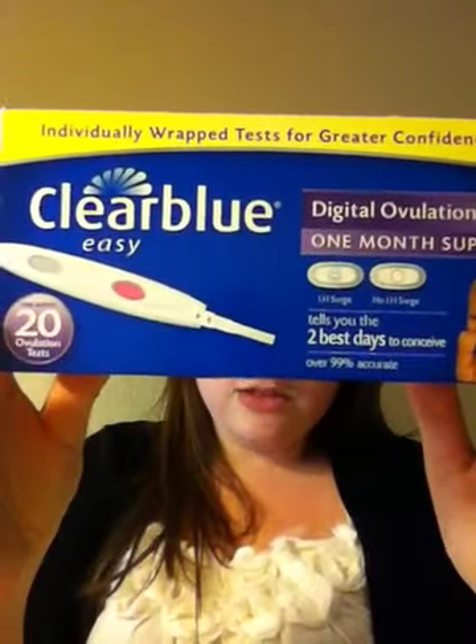This product review is for the Clearblue Easy Digital OPK.